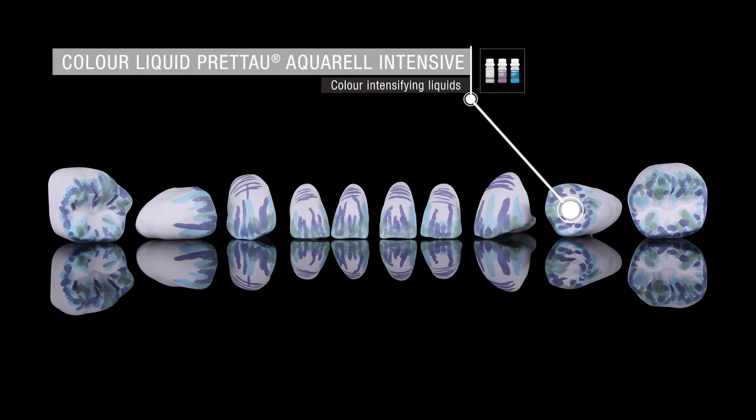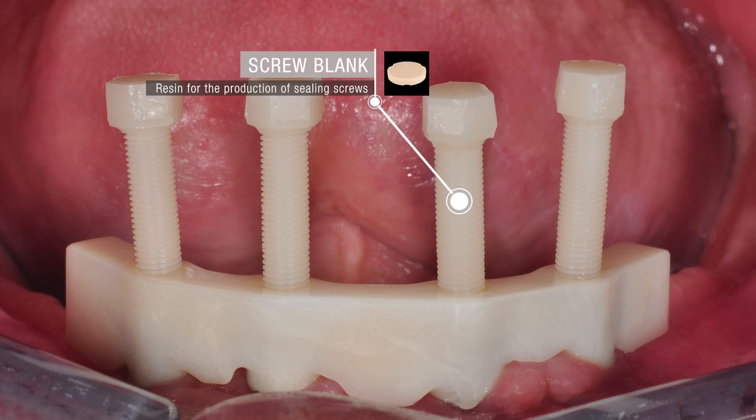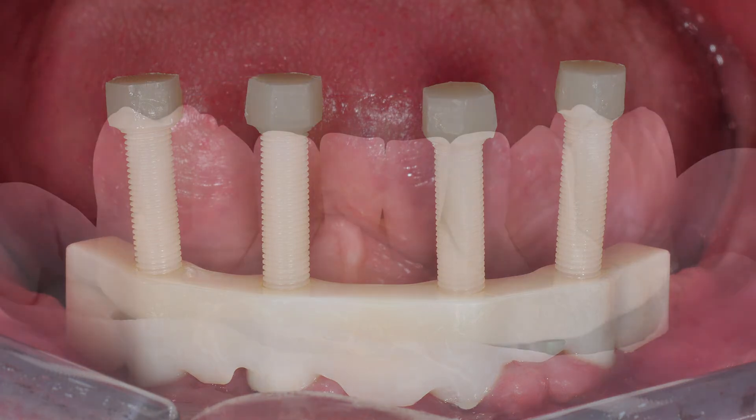The individual teeth were individualized with the color liquids Preto Aquarell Intensive Colors. To seal the screw channels in the bar, specific sealing screws were produced. The individual teeth were then bonded to the secondary structure.